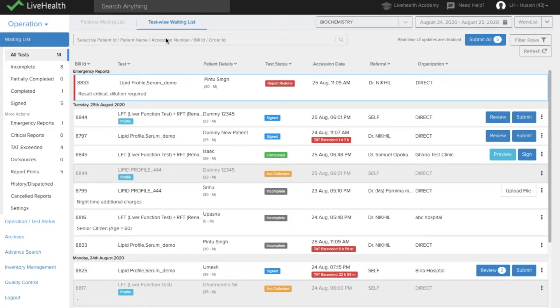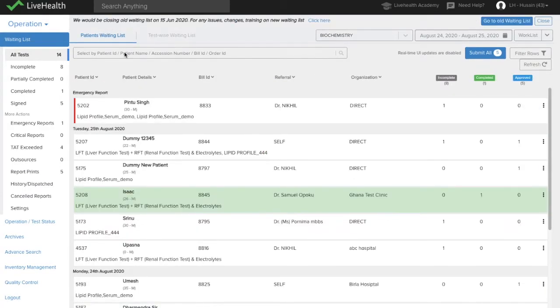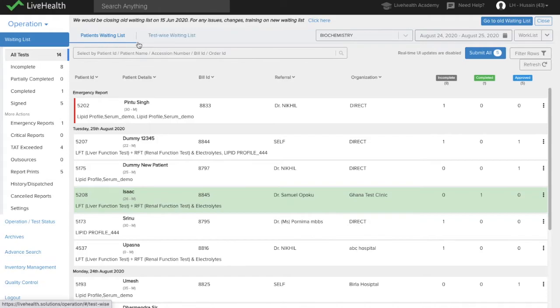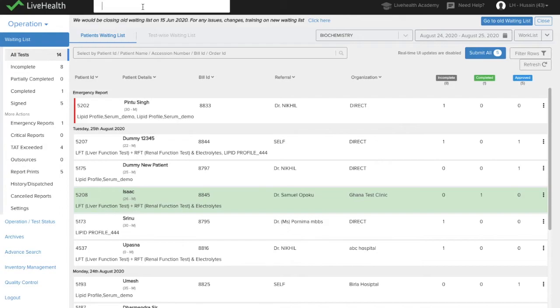You also have the search on the top. So you can search patients by the name, accession number, bill ID, order ID. You can search patients over here. If this search searches the patients which are there in this waiting list, but you can also search patients beyond the waiting list in this global search.